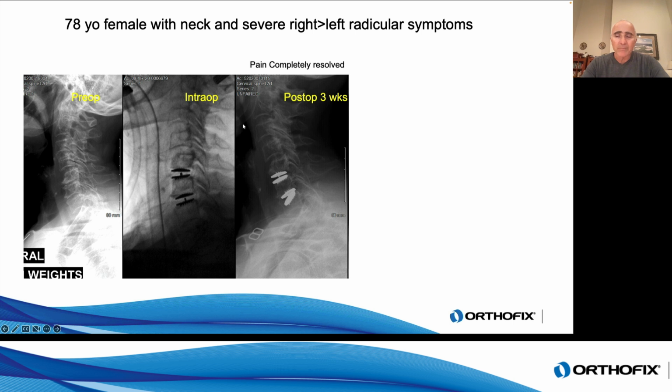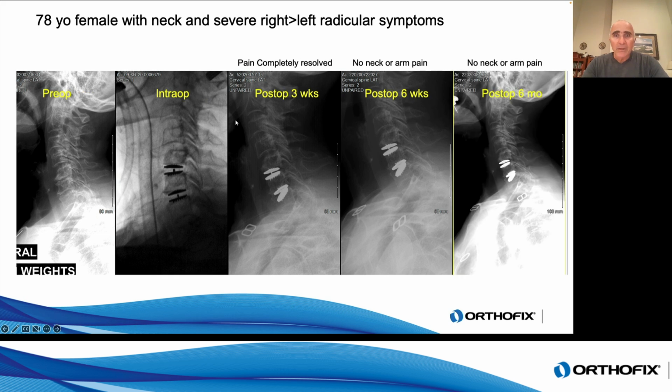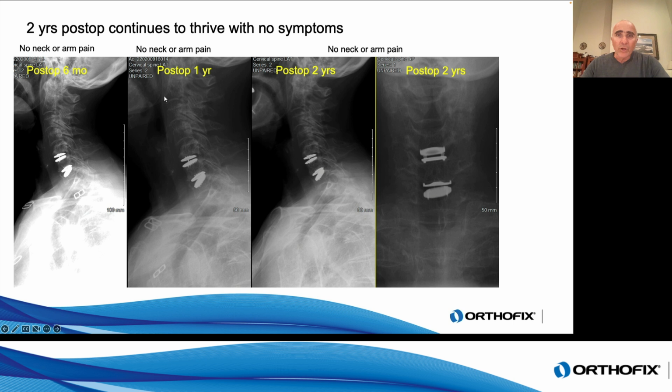and subsidence. Decision was made to watch this, but instead of routine follow-up at 3 months later, she was asked to return 3 weeks later. Here's her 3 weeks later at her 6-week post-op follow-up, still asymptomatic and stable subsidence. Here's her follow-up at 6 months with no symptoms or radiographic progression. Then all the way out to 2 years where she has gone on to fuse that segment with no clinical sequelae.